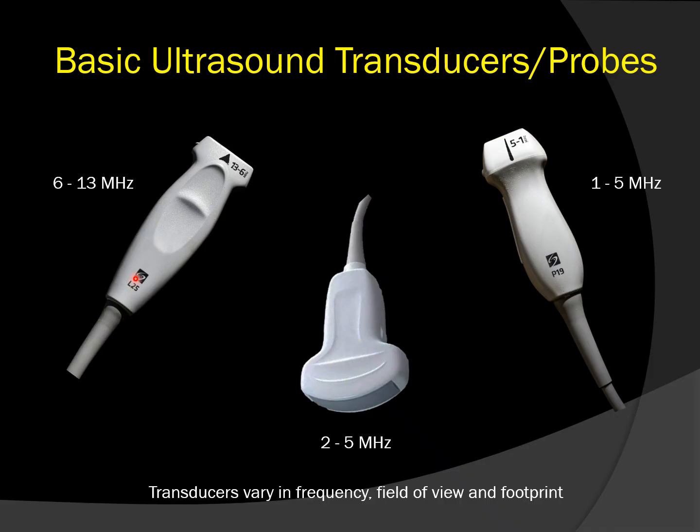As electrical signals come down the probe, there are typically lead-based crystals at the end of the probe that have piezoelectric properties. They convert the electrical energy into mechanical energy, which we call sound waves, traveling through tissues. However, for every second in time, 9/10 of that second, they are actually waiting for the sound waves to return, at which point they change the mechanical energy back into electrical energy, sending that information back to the computer, which will create the image.